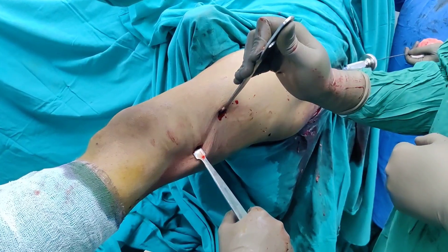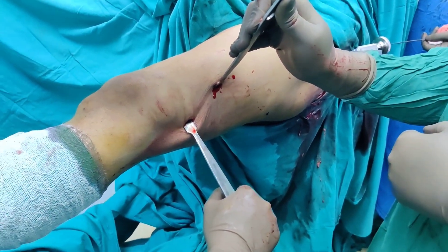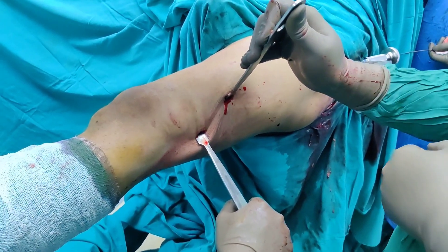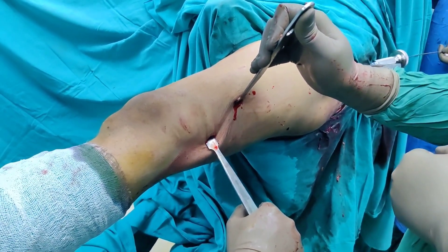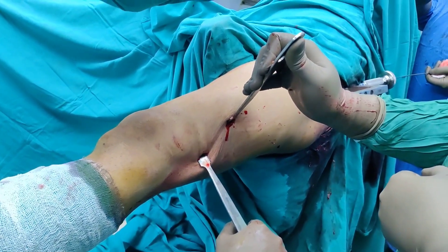If the procedure is going to take long you can use two people. One person — Amit — is lifting it up and Nitesh is putting the proximal fragment down and laterally. Let us see if we are able to reduce the fracture.